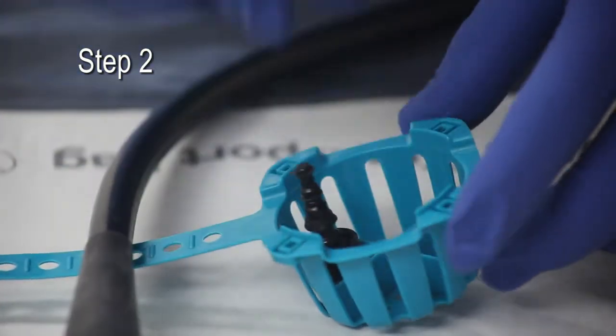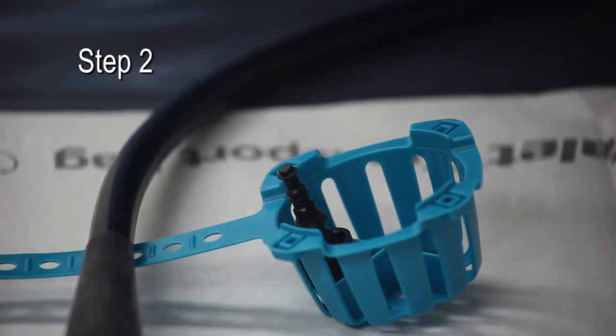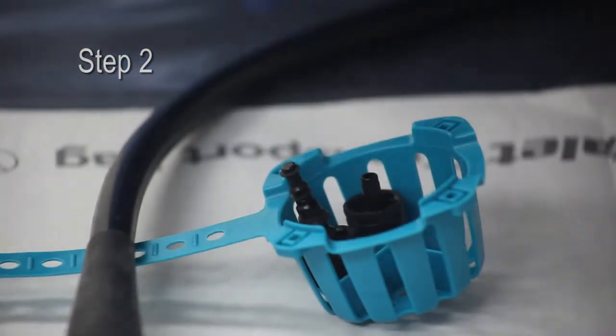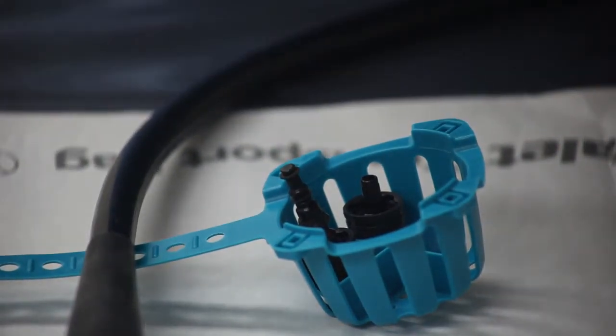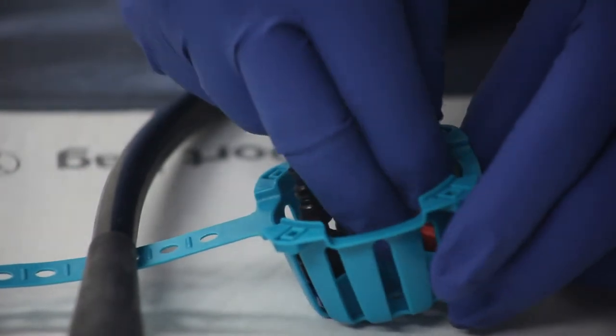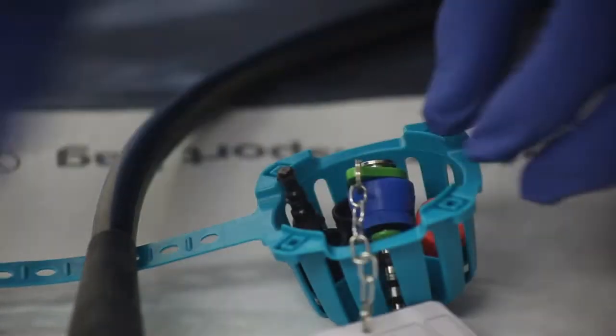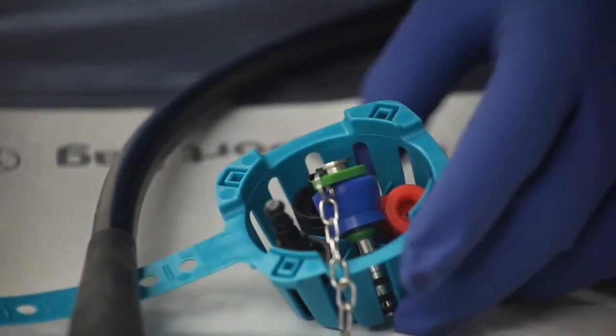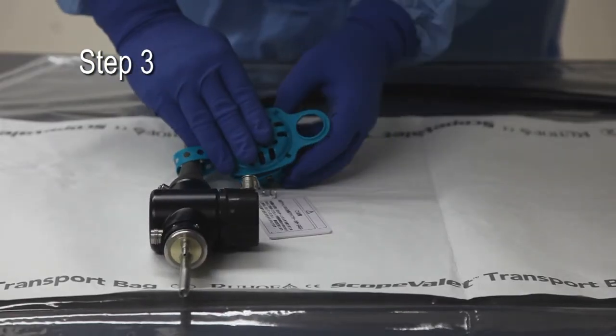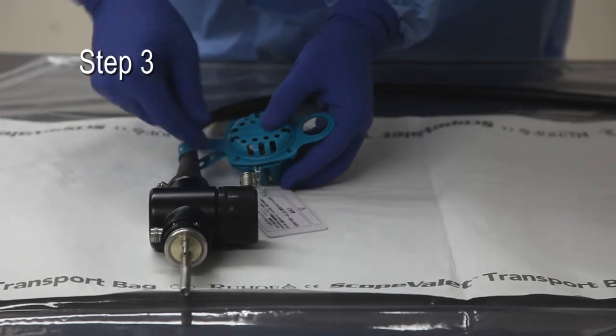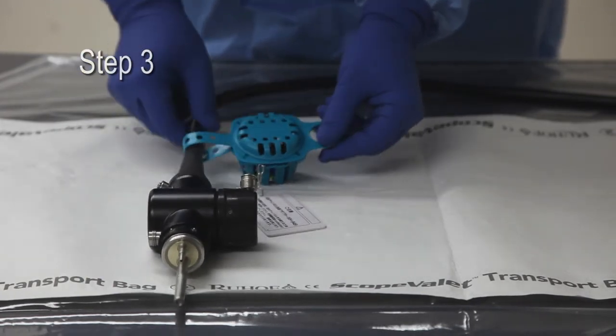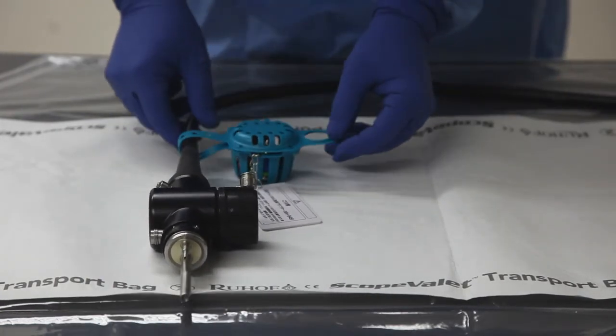Place the valves into the open ValveSafe. The chain of the air-water cleaning adapter should pass through a recess so that the plastic instructions remain outside of the cage. Close the top of the ValveSafe around the scope's umbilical cord, ensuring the four pins are fully located into the opposite housings.